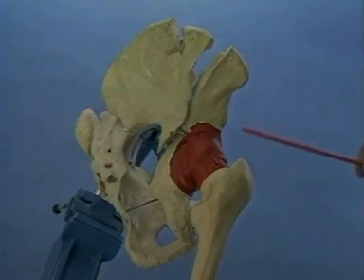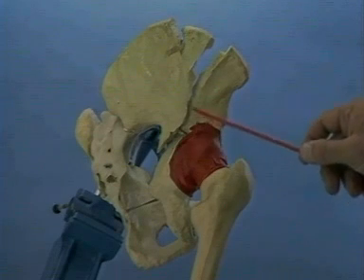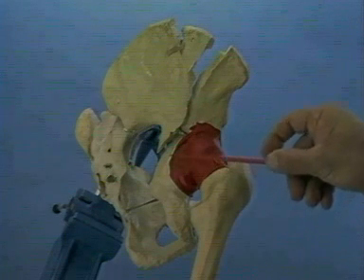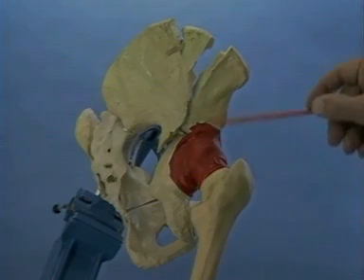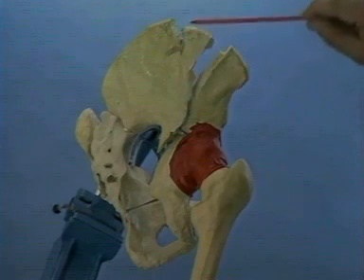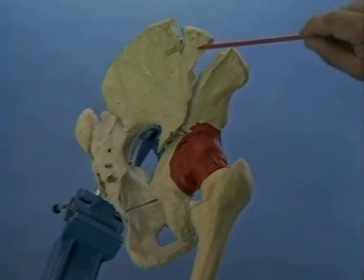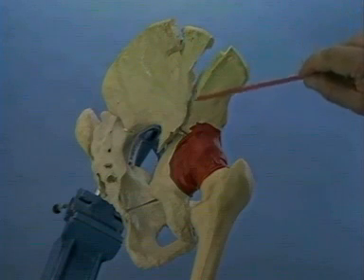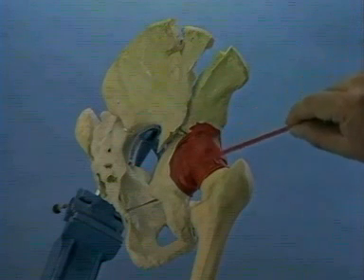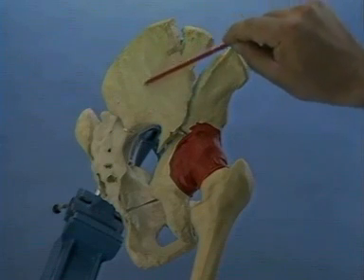Shown is the both-column fracture of the acetabulum. The anterior and the posterior column are completely separated from the intact portion of the ilium. No portion of the articular cartilage remains attached to the intact portion of the ilium. There is a triangular segment of the ilium found at the iliac crest. Open reduction and internal fixation of this fracture can be performed through the ilioinguinal approach because the posterior column fracture is simple — that is, the posterior column remains in one piece.